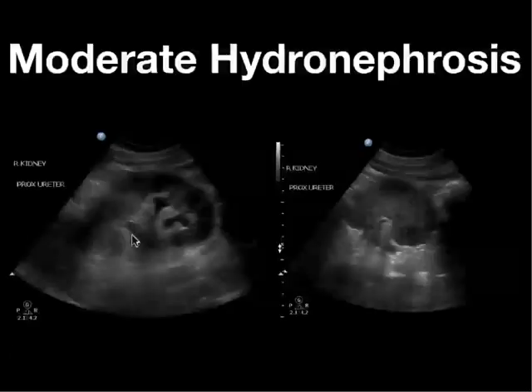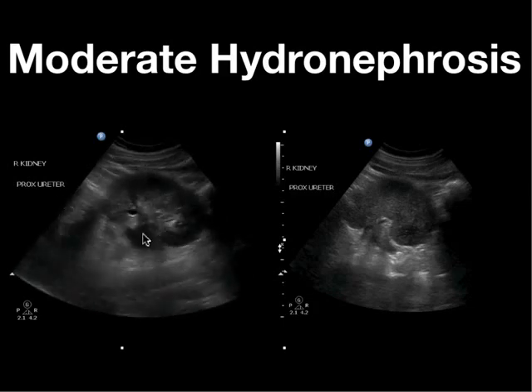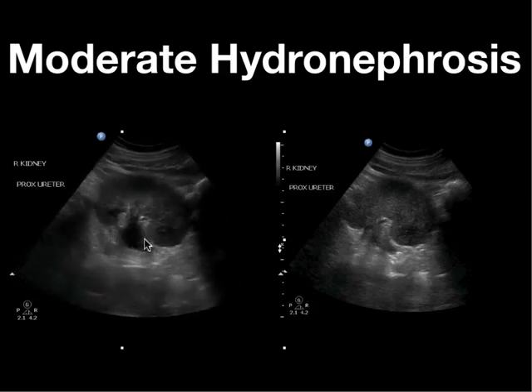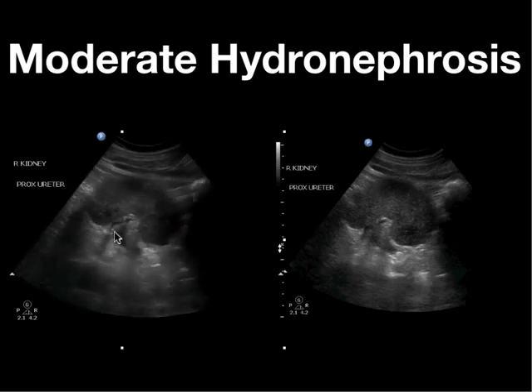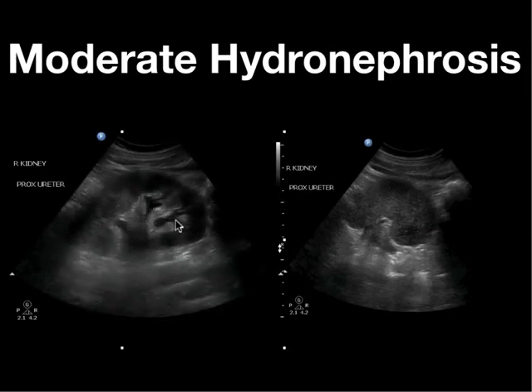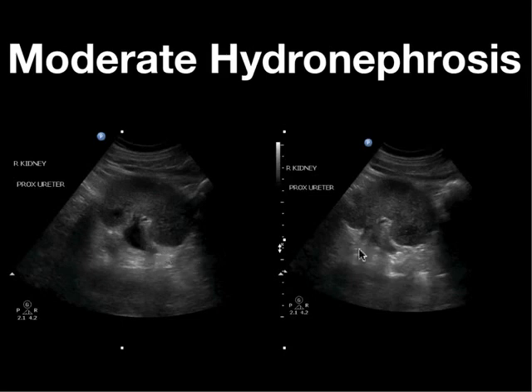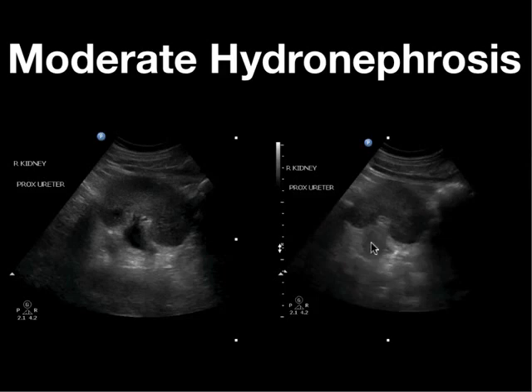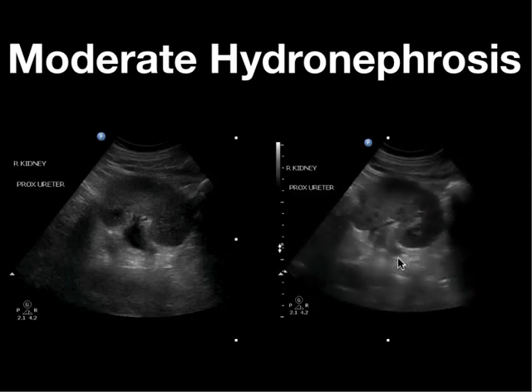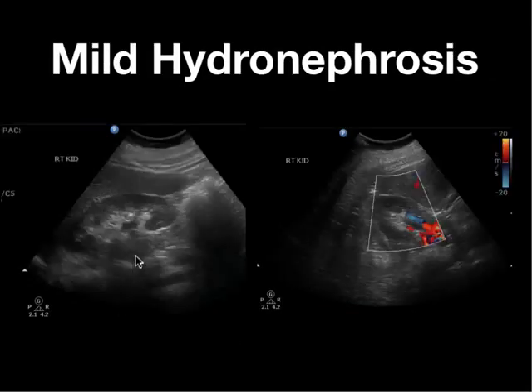Here's a patient with moderate hydronephrosis — you can see the dilated renal pelvis, the minor calyces all connecting and draining into the renal pelvis, and a bit of the proximal ureter. Here you can see evidence of the offending stone — this was a patient who had a proximal UPJ stone.